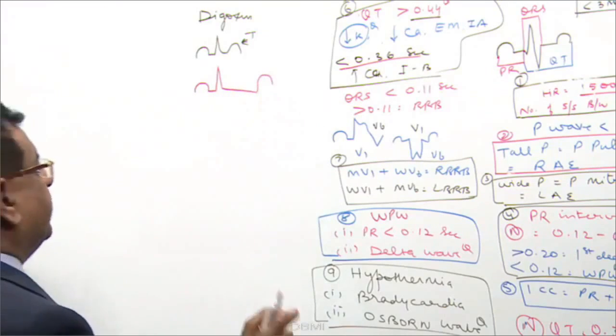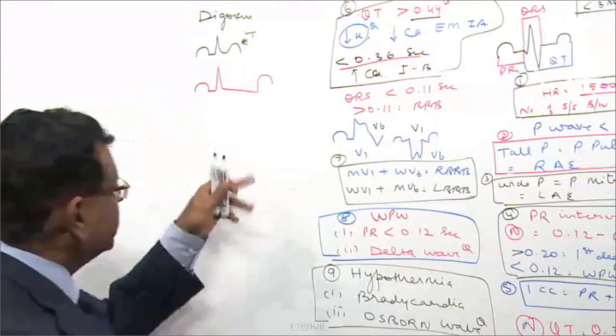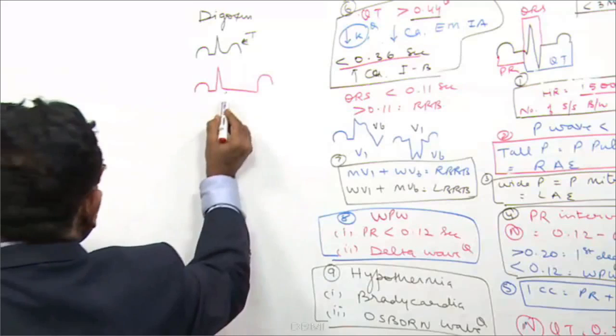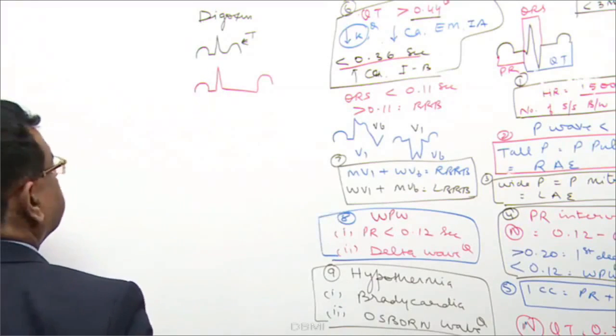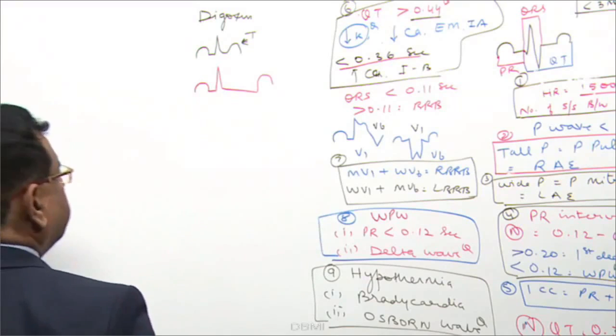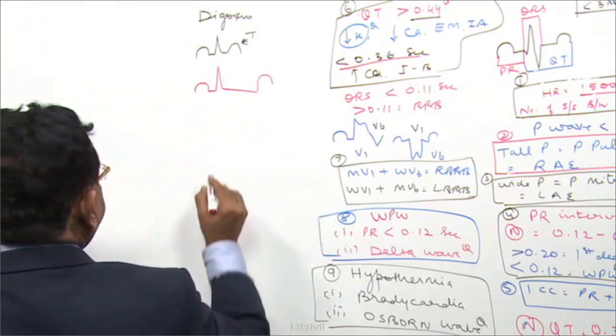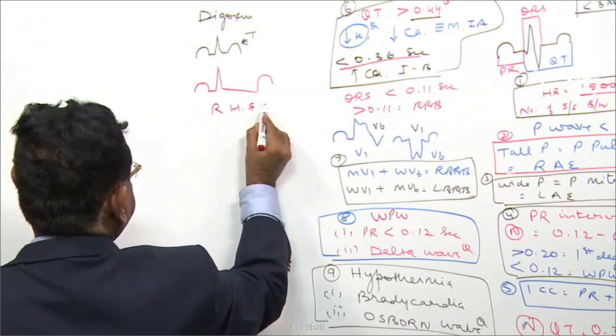Okay, all of you just wait. You first notice, then I'll give you time to write down. So I get a recording like this. Actually, I am getting ST segment depression, but from ages it has been called the reverse hockey stick sign.